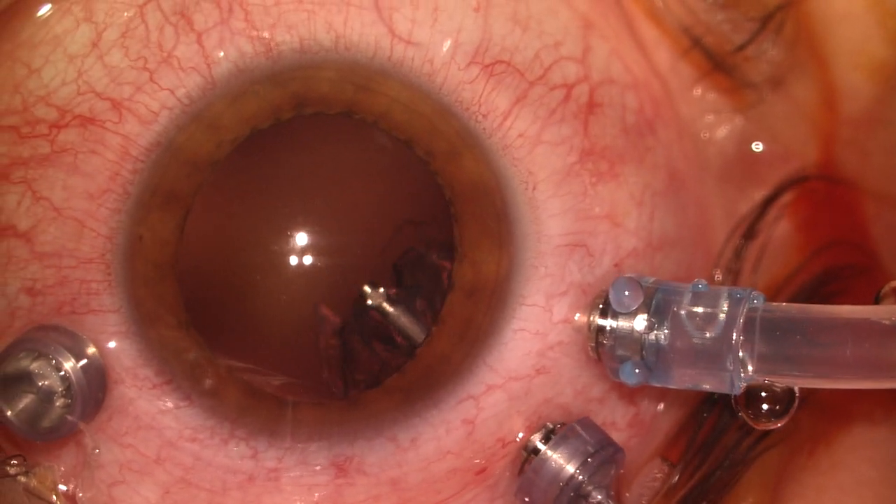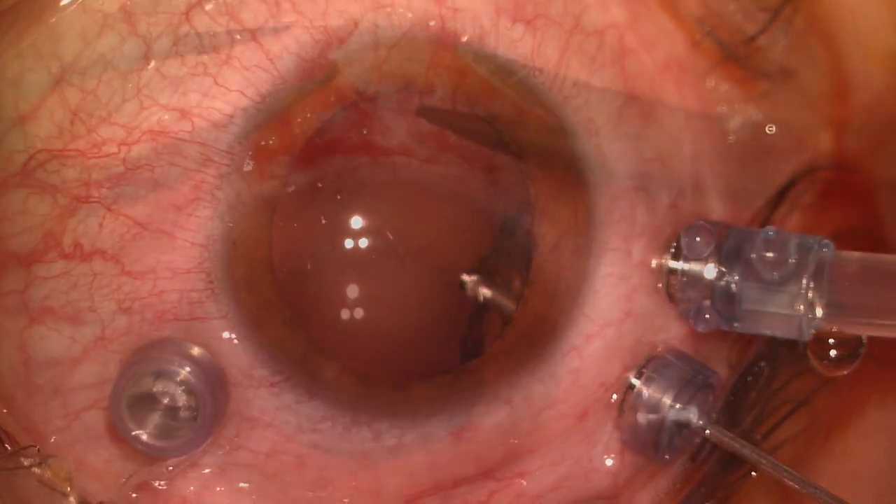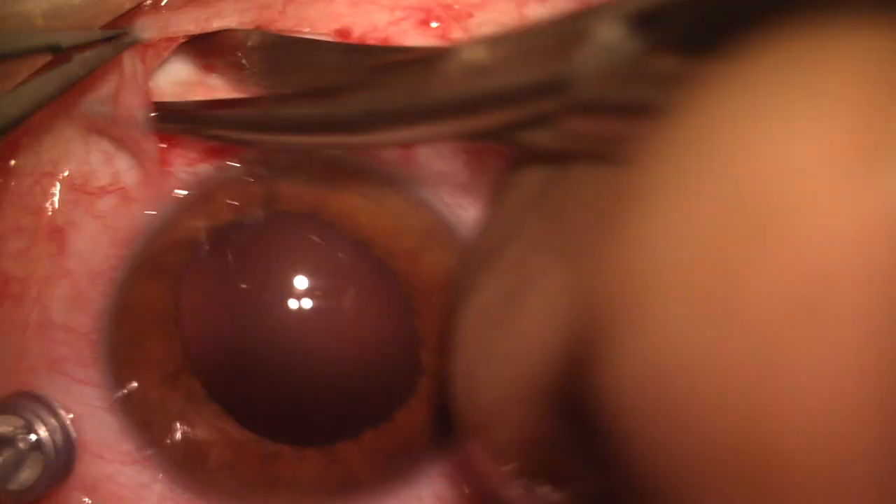First, a pars plana vitrectomy is performed. After that, the conjunctiva and Tenon membrane are opened at 6 and 12 o'clock.